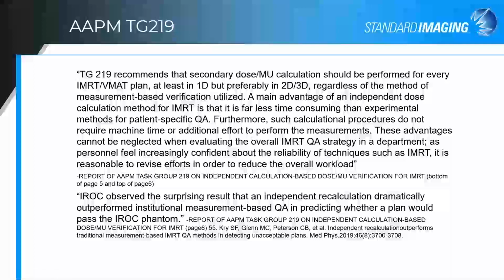measurement techniques. And then another statement that I thought was pretty interesting is that these advantages cannot be neglected when evaluating the overall IMRT QA strategy in a department, as personnel feel increasingly confident about the reliability of techniques such as IMRT.